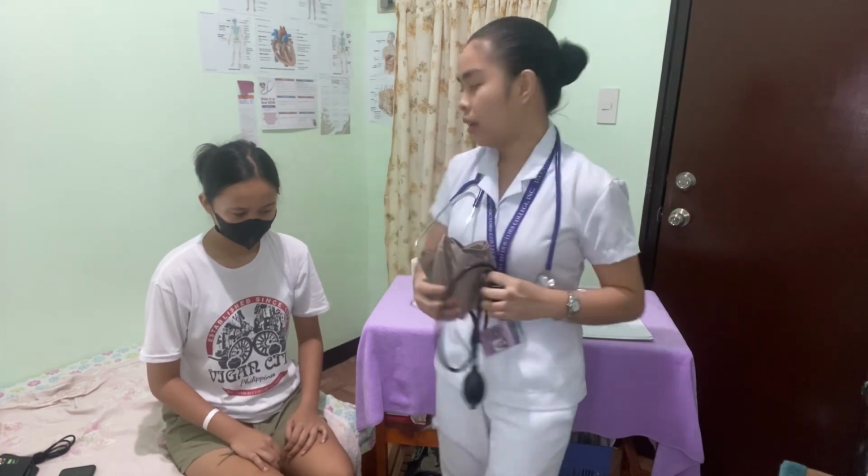And so I already have her blood pressure, and after doing the procedure, I'm gonna need to fully deflate the cuff and wipe the cuff with a disinfectant so it could reduce the risk of cross-contamination.